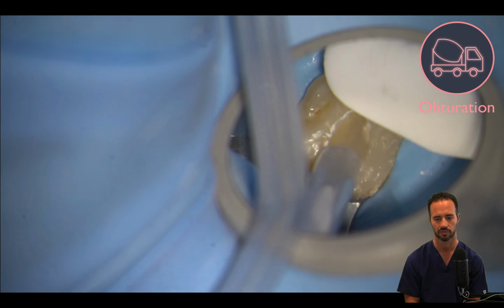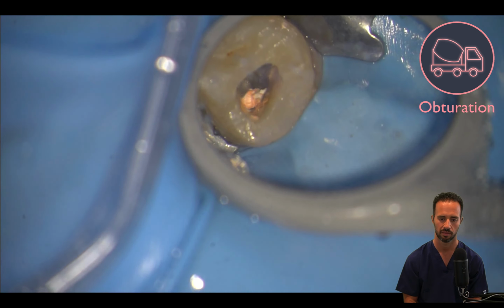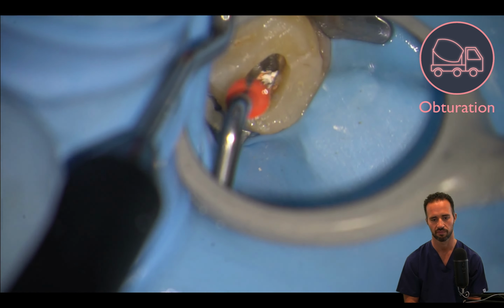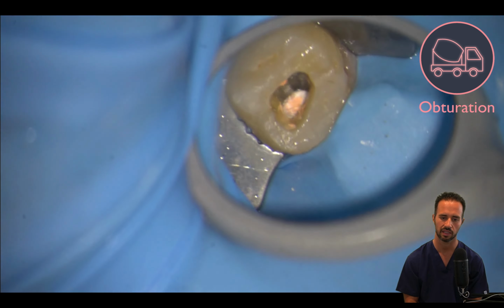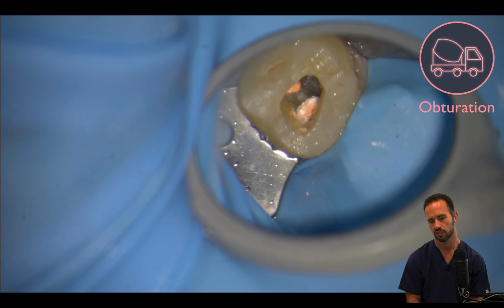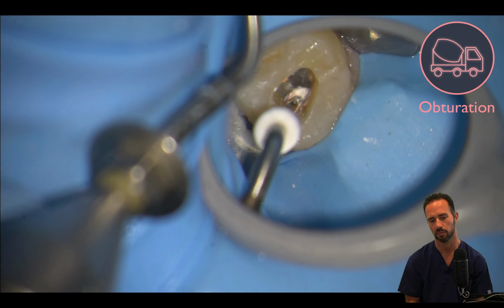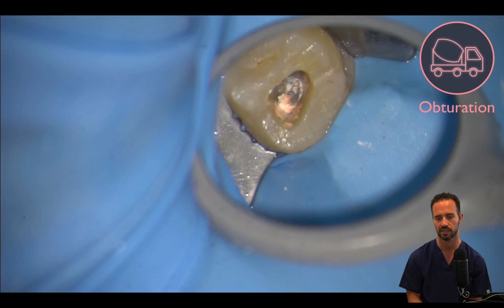in this scenario. So a lot of water here just to remove the excess sealer, but you can see this is basically finished here. You want to have a nice clean area to work with. So we're just completing our obturation phase, and then we're going to proceed here in just a minute with the restorative phase of the treatment.